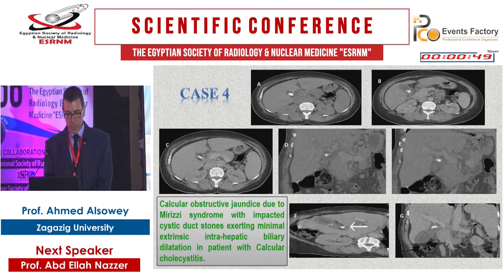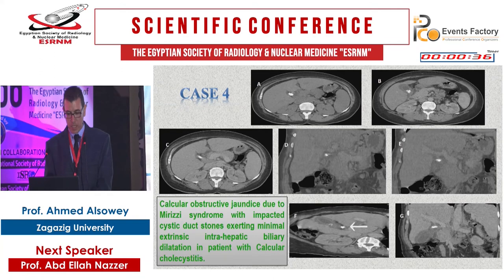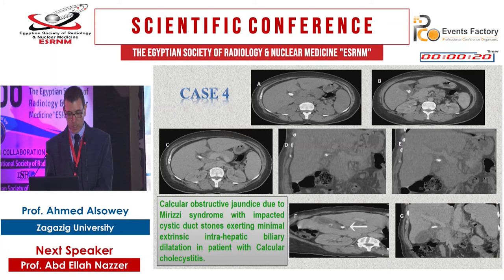Another case shows an impacted cystic duct stone compressing the biliary duct externally, as well as a gallbladder stone with thickening of the gallbladder wall and a pericholecystic collection. The coronal reconstruction revealed the presence of the stone outside the common bile duct and compressing it. This represents calcular obstructive jaundice due to Mirizzi syndrome with an impacted cystic duct stone causing biliary dilatation in a patient with calcular cholecystitis.